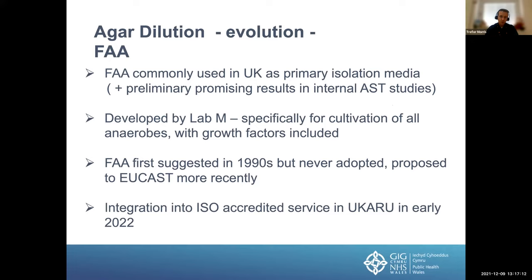So I hinted at developments using FAA, and this is something that obviously we're very familiar with here. It's been commonly used here as our primary isolation media for decades, since it was developed in the 90s by Lab M, and it's specifically designed for the cultivation of all anaerobes, with all the growth factors that we currently add to Brucella already included as part of the formulation, which gives it a huge advantage. And we're integrating this into our service in early 2022. Next slide, please.